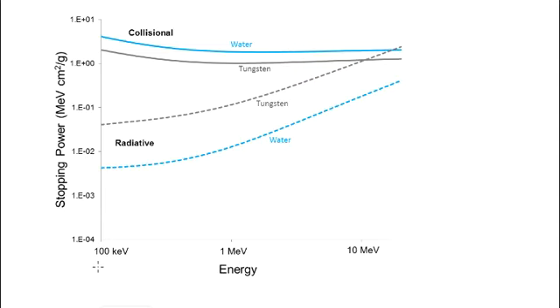Another design consideration is that you're heating the anode. There are collisional losses of electrons inside the anode, and that heats up the anode. If you heat it too much, the anode may melt. That would be bad. If you remember back from video 7.2, collisional losses can be quite large, especially when you're talking about low energy electrons. So it's an important thing.